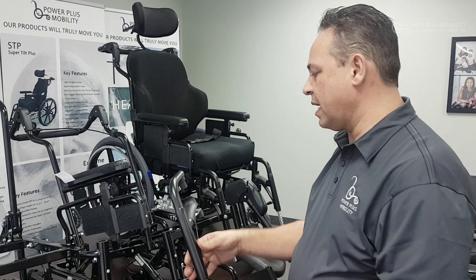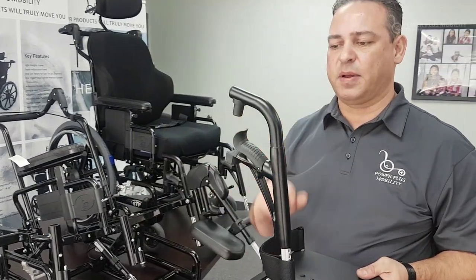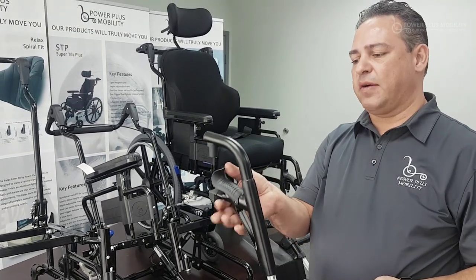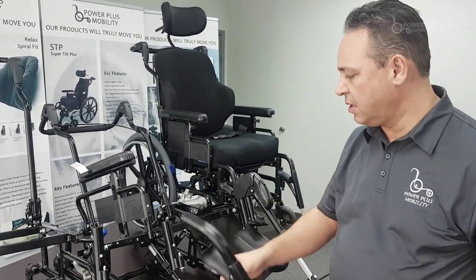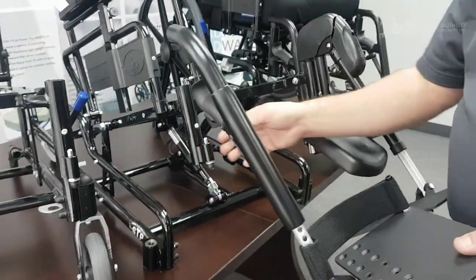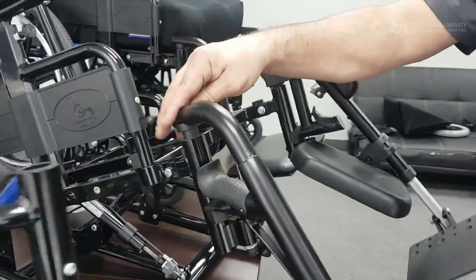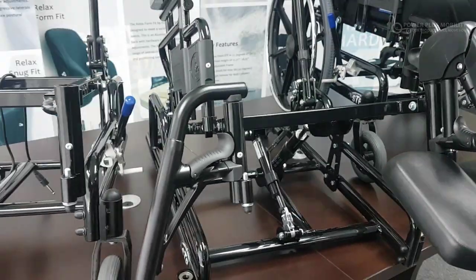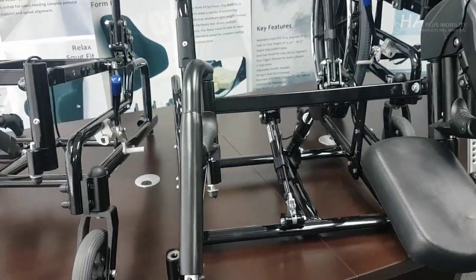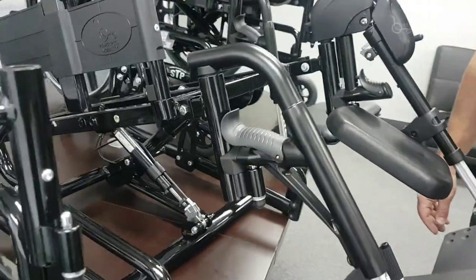Our most common type of footrest is the center pivot. It has a latching mechanism here which engages another mechanism, allowing it to trigger and lock into place. I'll turn that — it comes up and locks just like that. Now our front rigging is locked into place.